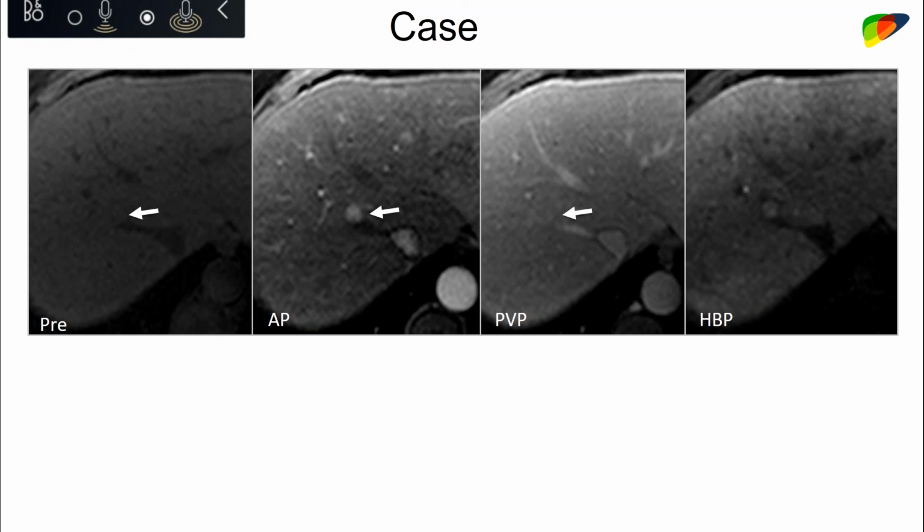So say we had a LI-RADS 4 nodule. This is not 2 centimeters, but a 12 millimeter nodule, and this nodule is an LR-4, and then we have a very similar nodule, but it is hypointense in the hepatobiliary phase, and it is also LI-RADS 4. We would not treat those differently. We would treat those similarly. So it would be a nice piece of knowledge, but I don't think it would change our treatment paradigm at all. Okay, thank you, Bill.